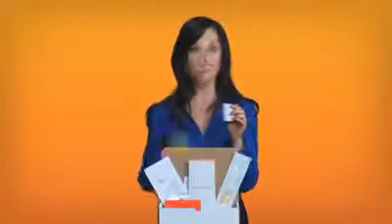Now that you have all the right components, it's time to collect your urine sample. I know, not the most fun part of the process, but you'll be thankful later. Take the collection cup and hold it directly in line with your urine stream. It's important to be sure to catch the first part of your urine stream. Fill the cup to about half.